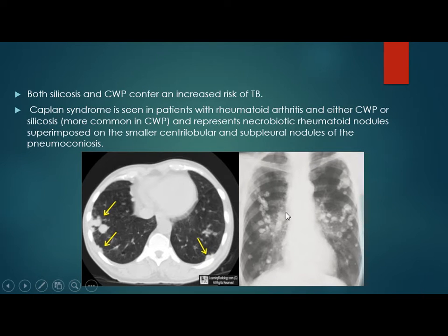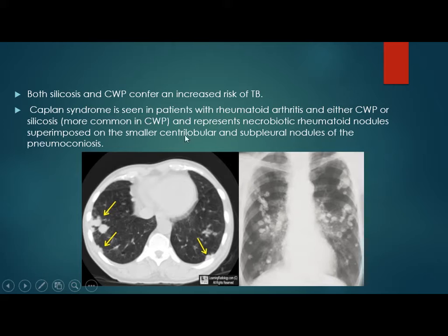This CT scan and chest X-ray of a patient with rheumatoid arthritis with a background of coal worker's pneumoconiosis shows necrobiotic rheumatoid nodules superimposed on small centrilobular nodules of the coal worker's pneumoconiosis. These nodules sometimes cavitate. Without history, no one would ever arrive at the diagnosis of necrobiotic nodules.